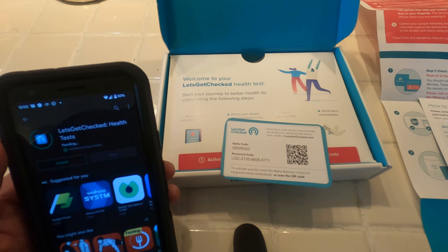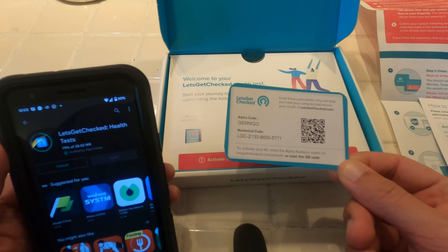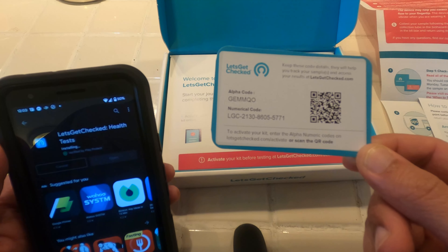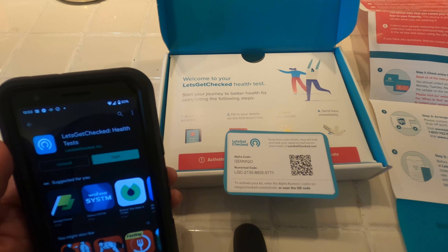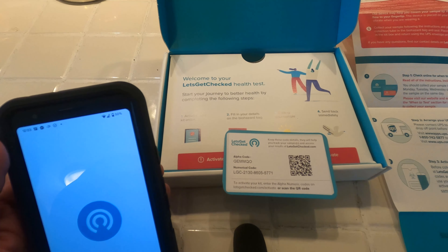I'm going to download the app because I want to be able to access information quickly on my phone, and also I can scan the barcode to activate the test — that is step three in the process.